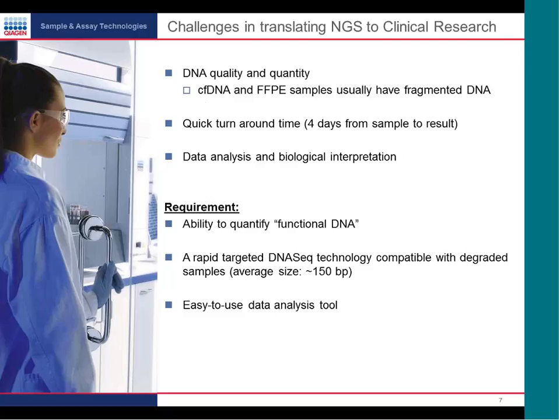Then for the clinical setting, we need a quick turnaround time. Four days from sample to result is more acceptable nowadays. And then let's not forget about data analysis and biological interpretation. This is still a bottleneck for next-gen sequencing.